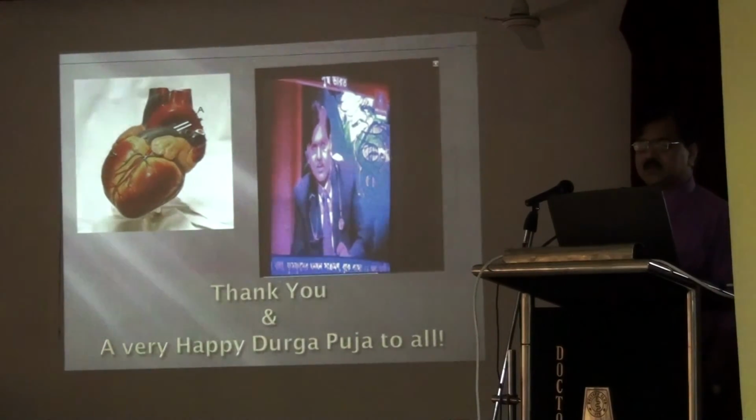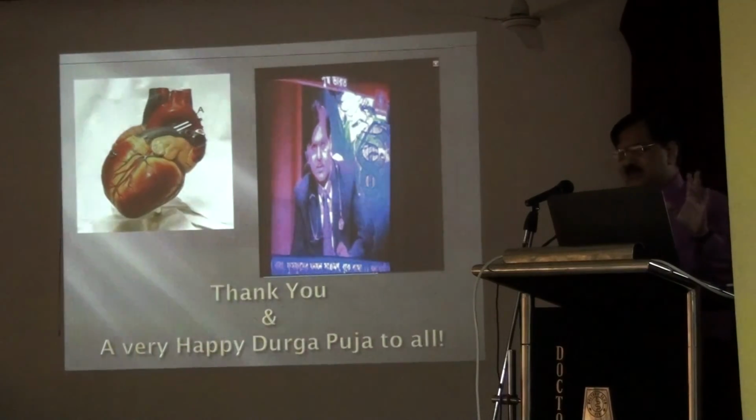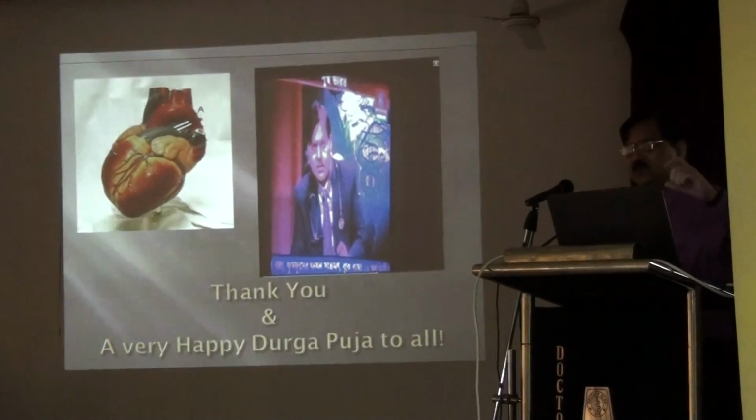But though pulmonary hypertension is very important, there are two cases we always try to avoid in echo. It is very frustrating if we are not getting a good window. One is COPD, because the lung is obstructing the heart, so whatever data we give you may be missing.